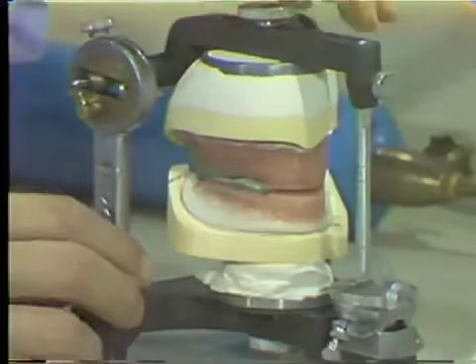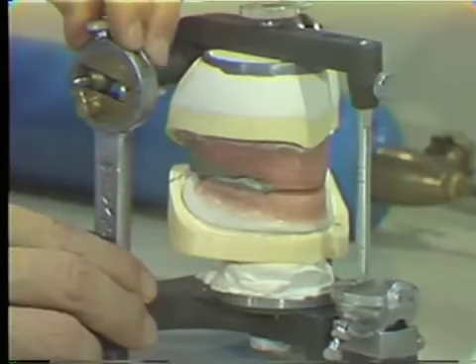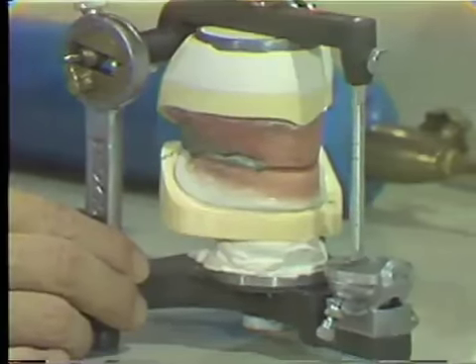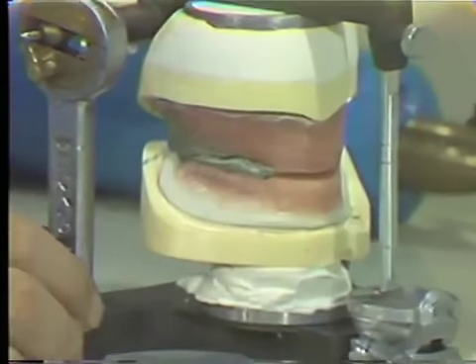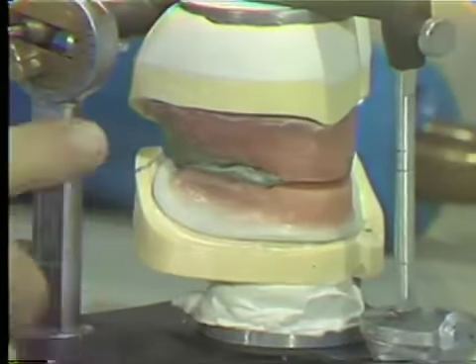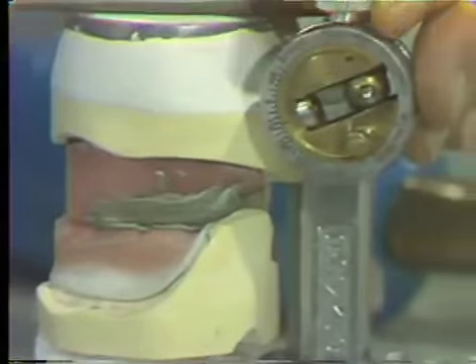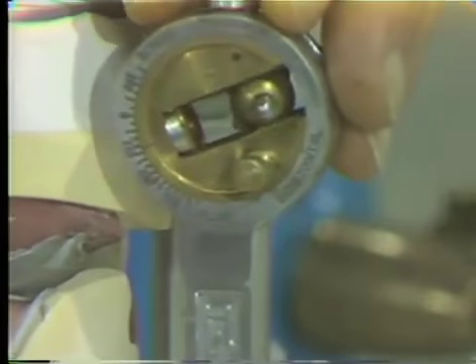And when I move right in this position, I get maximum seating on that side. I go back, move a little bit more, and there's maximum seating there. Now we will tighten our condylar mechanisms, and you see we read 10 degrees on his right side and about 24 on his left side. So we'll tighten those.